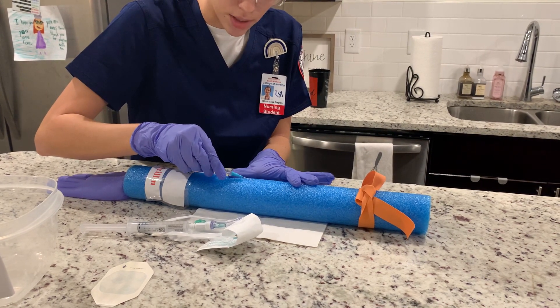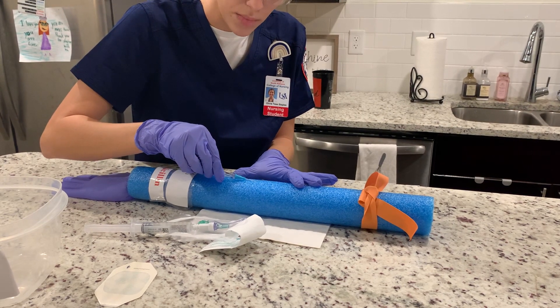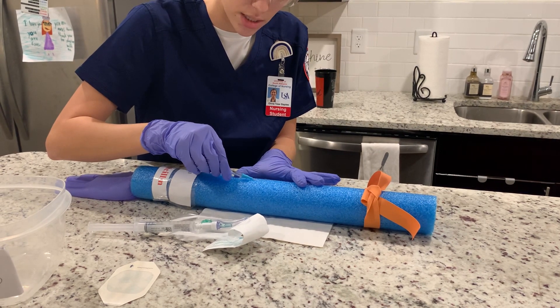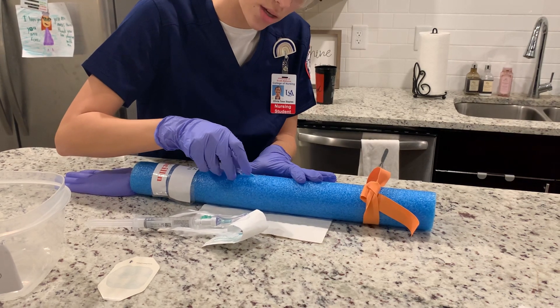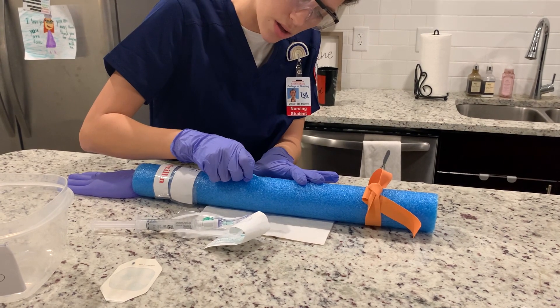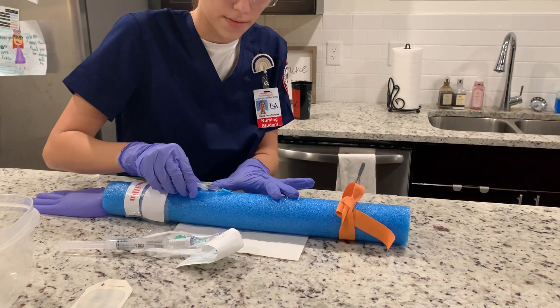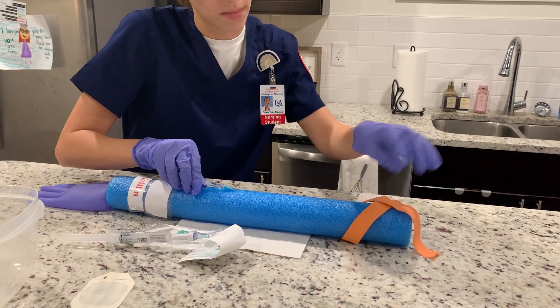Once I see blood return, I will lower it and advance it a quarter of an inch. Now I am going to advance the hub all the way in, making sure I do not take the needle in any further. As soon as I advance it, I'm going to release the tourniquet.